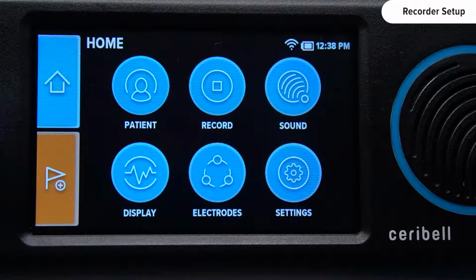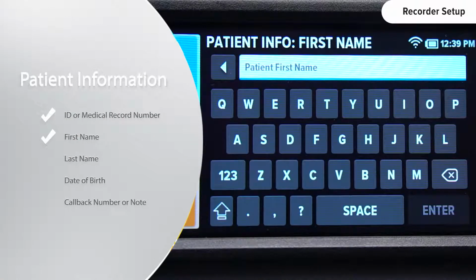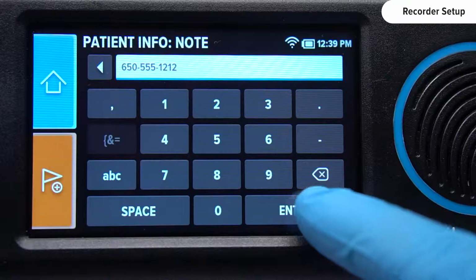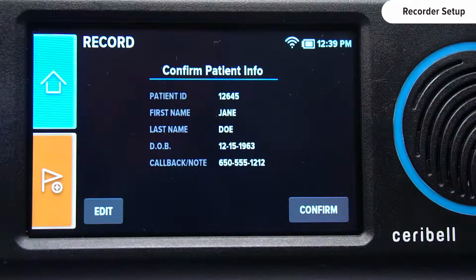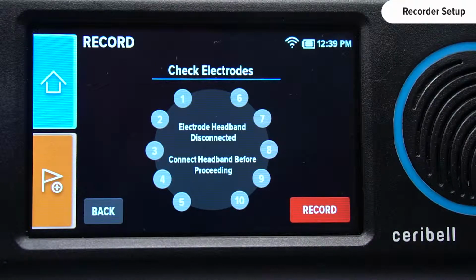Starting from the home screen, touch the Record button. Follow the software prompts and enter the patient's information. Once completed, you need to confirm the patient information. You cannot edit the information once the recording starts. After confirmation, the electrode screen is displayed.